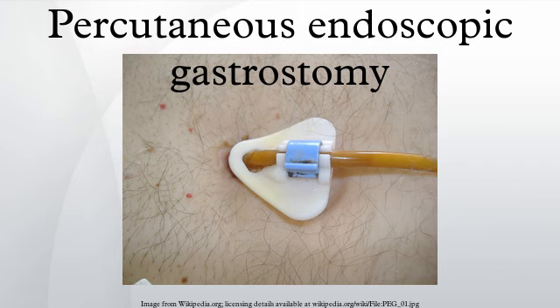In 2006, a variation, the loop PEG, was used in Singapore by Dr. Pang Ah San. By decreasing the risks of accidental tube dislodgement, and the risks during tube exchange, the loop PEG gives a better risk-benefit ratio. See also: feeding tube, minimally conscious state, references.